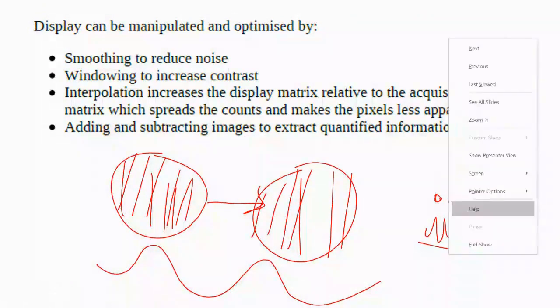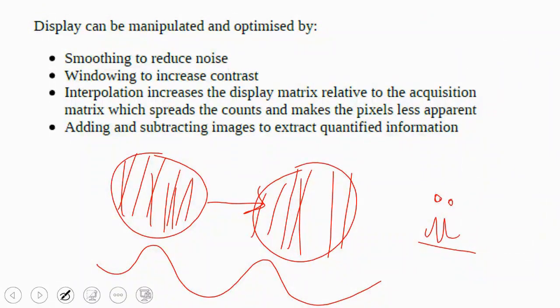I want to ask you to move a bit. When patients come to me and inject radioactive material, the radioactive material is supposed to target what? It targets the organ, right? For me, the organ where the radioactive material has gone will be very bright.